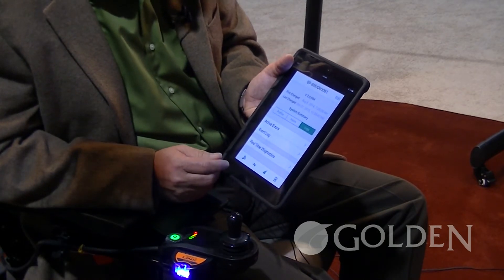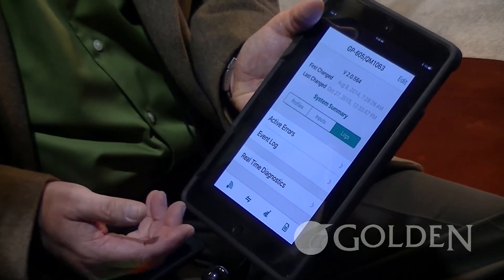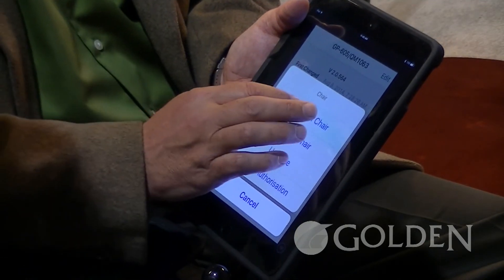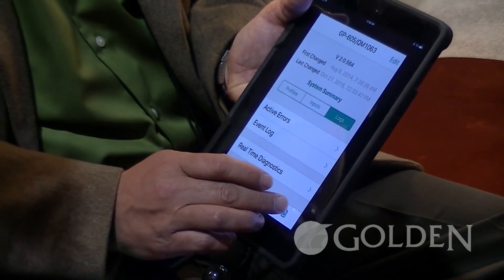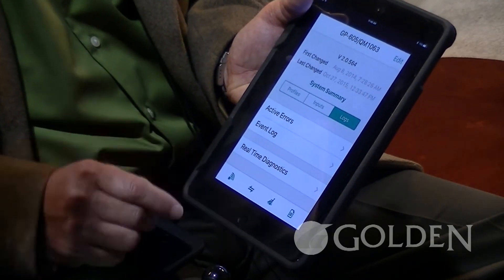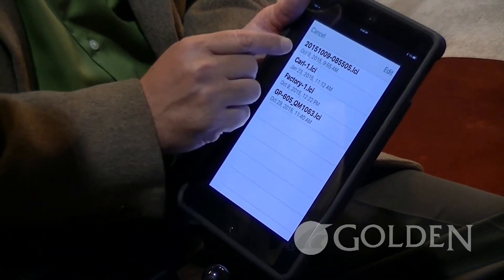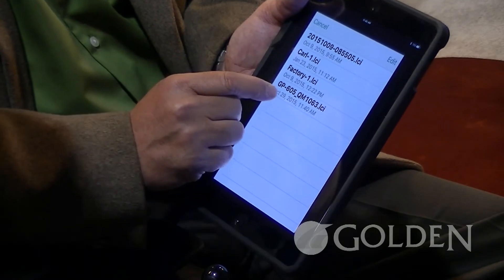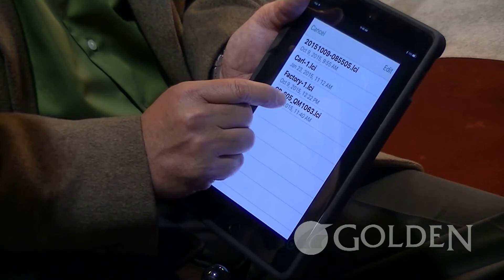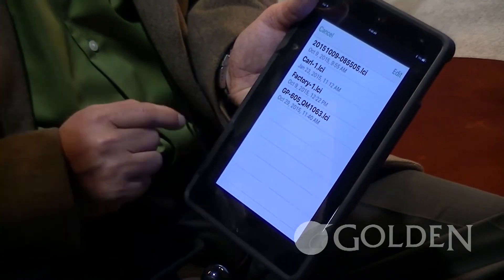Another really nice feature is that as soon as you take the chair out of the box, we want to save it to file. We'll hit the wheelchair icon, read from chair, go to logs, and save. Now it has just saved this chair to a file — October 29th, 2015 at 11:40 AM. We can change this to Ms. Jones, a serialized number, whatever the case might be — it's loaded and ready to go.